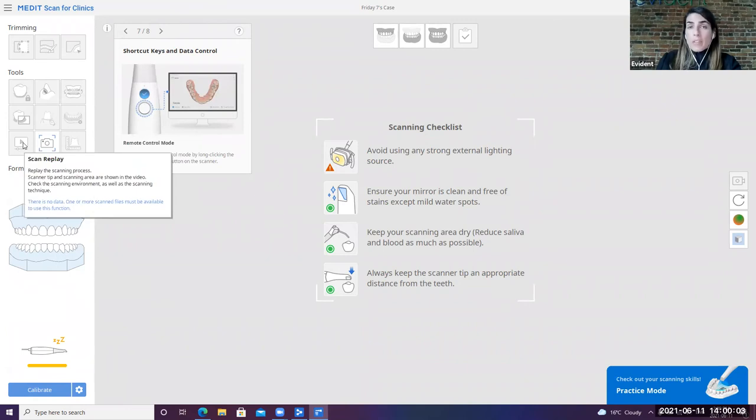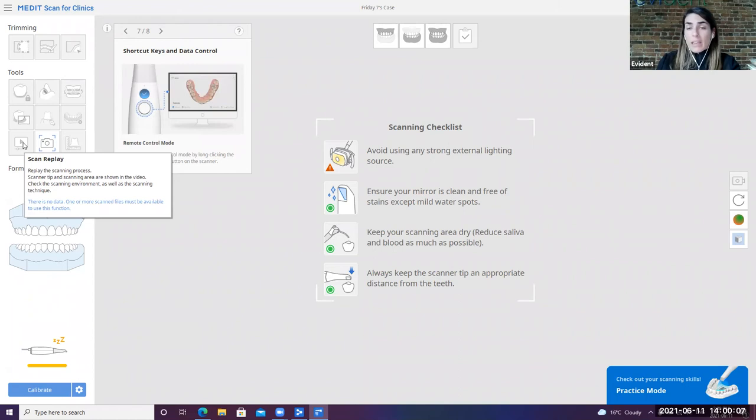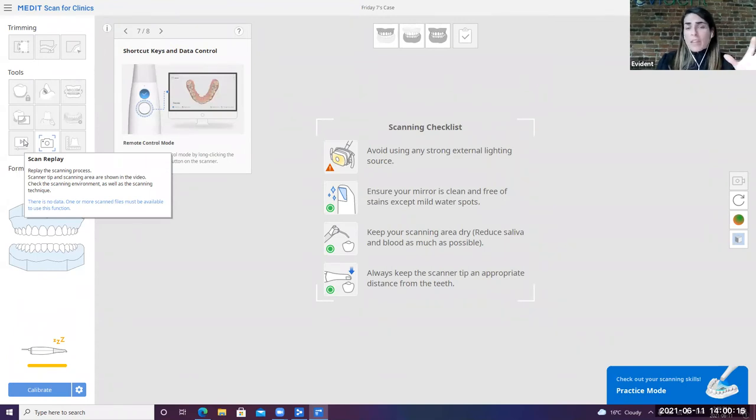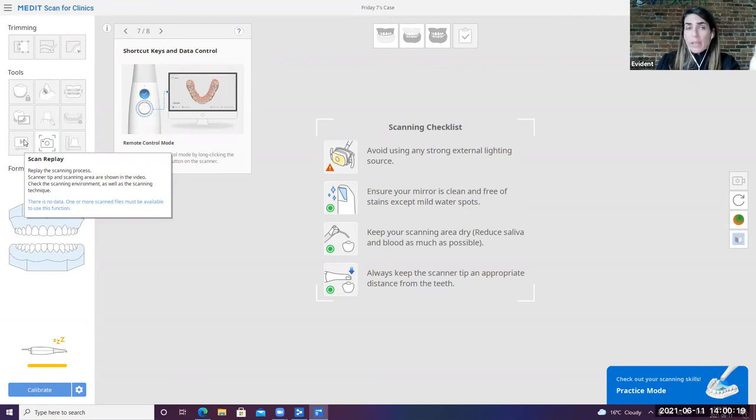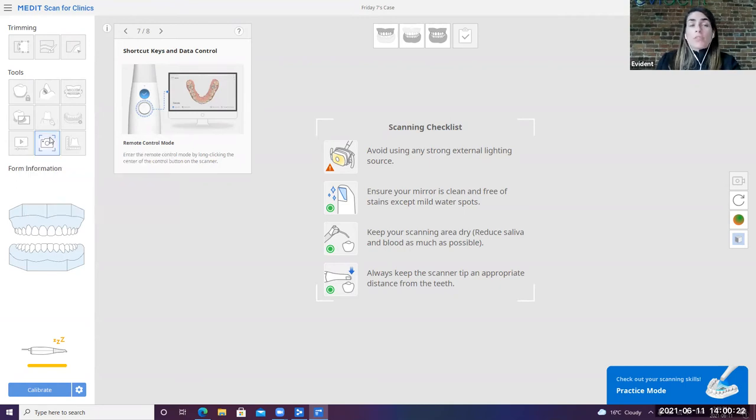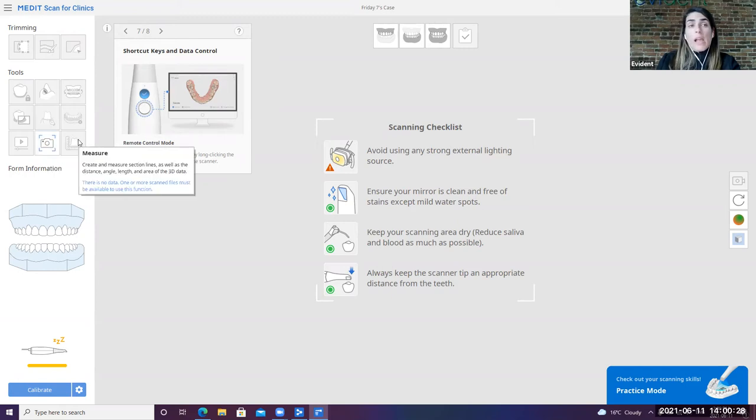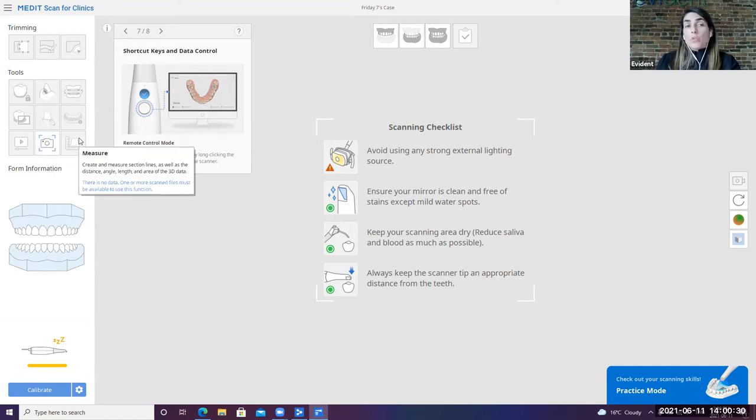You can also replay your scan. So this is helpful if you've got staff that maybe perhaps haven't done a lot of scanning. They're really stuck on a case. It's taking them seven minutes to scan a patient. They can actually go back into the scan and replay it and take a peek at their scanning strategy in order to be able to see the areas of improvement that could come with that assessment. You can also take HD photos. The quality of it is actually quite good, and I'll take a picture of that throughout our demo, too. And there's also an ability to take measurements as well.